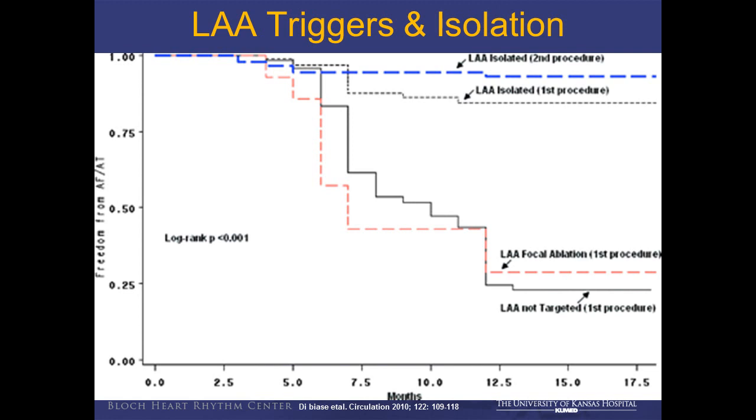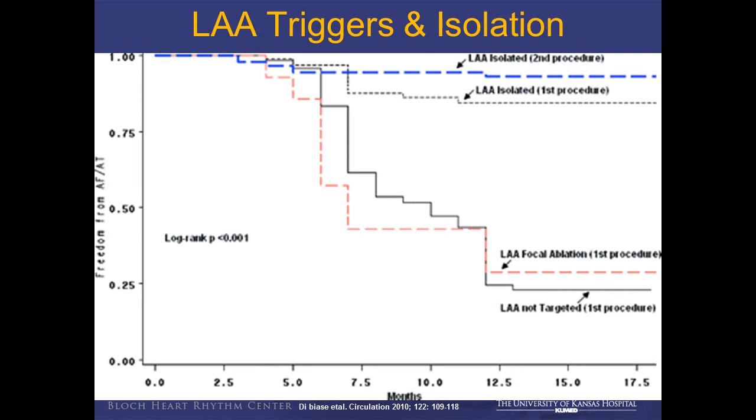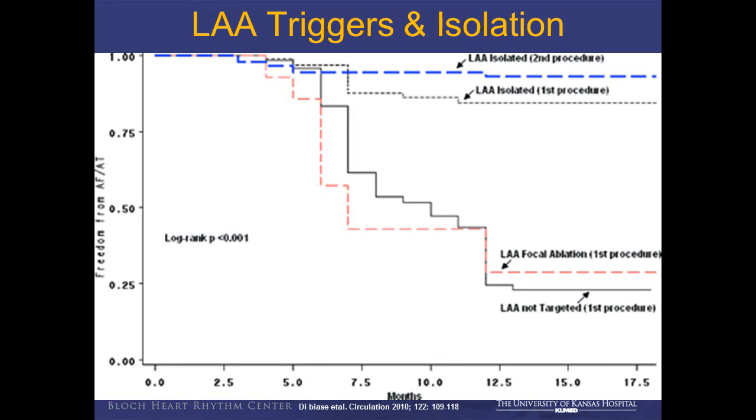I think of a lot of people that I know, Andre probably mastered this skill the most, and there are a lot of times I'm calling him, okay, fine, I'm here in this location, I burned a lot, but I'm not able to still get it. I think that's where the differential approaches of getting into the coronary sinus or identifying the Bachmann bundle that is still attached to it in some of the angles, those are all the things that are necessary to understand this.